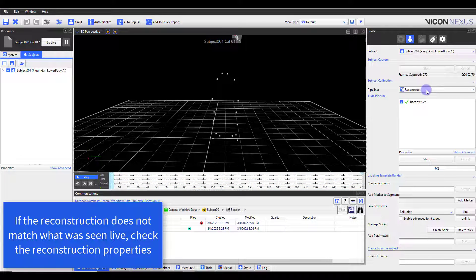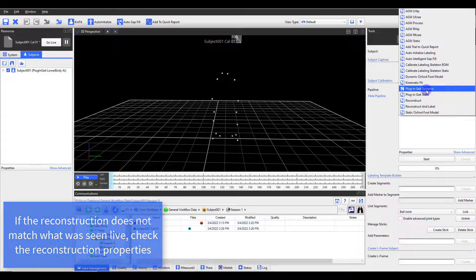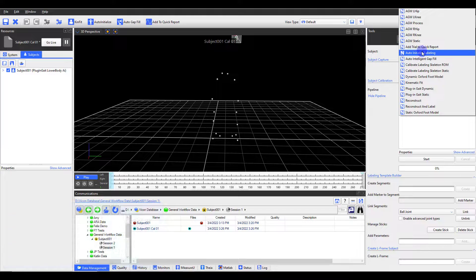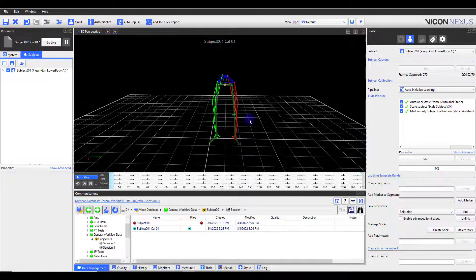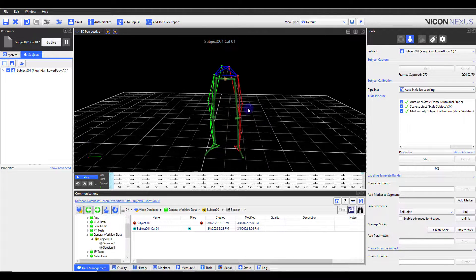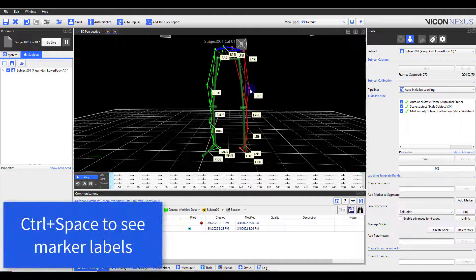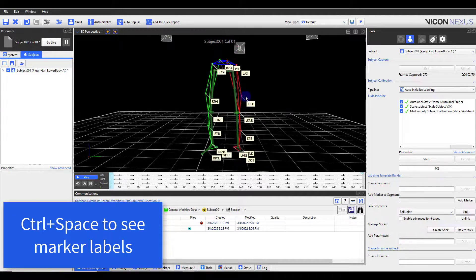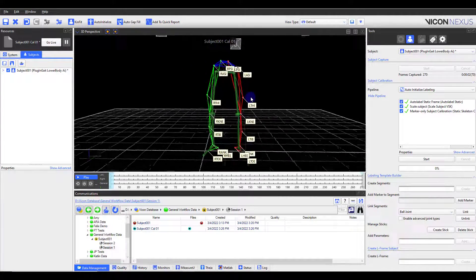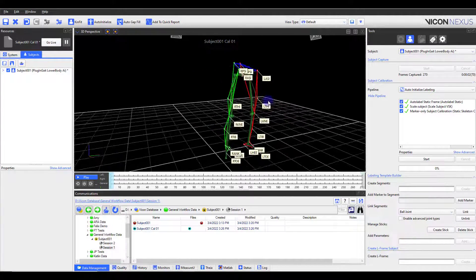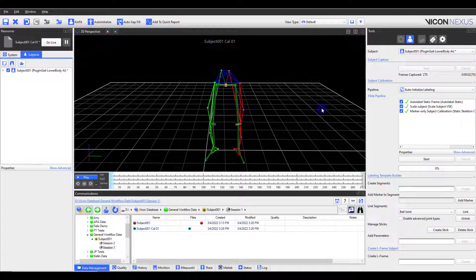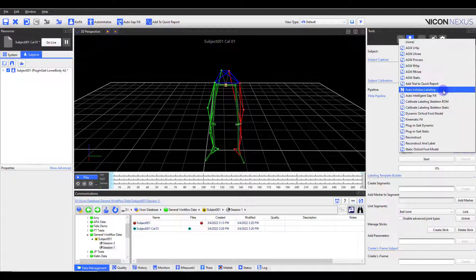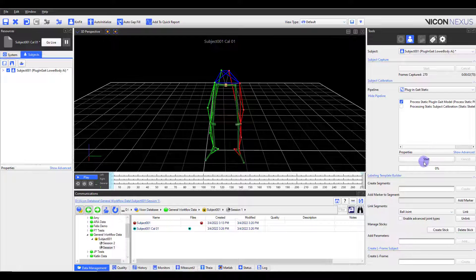Next, I will run the auto-initialize pipeline, which will auto-label the static pose and run the calibration operations. It's a good idea to check the marker labels at this time. If you notice any incorrect marker labels, you will need to correct them and run the calibration operations again. If the marker labels are correct, I can also run the static model at this time.